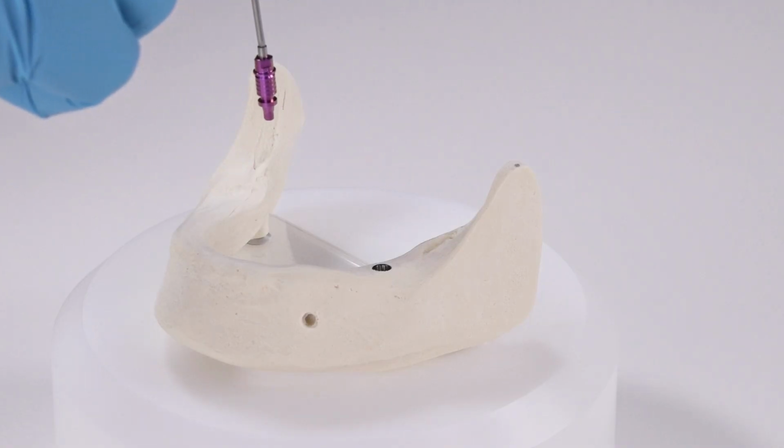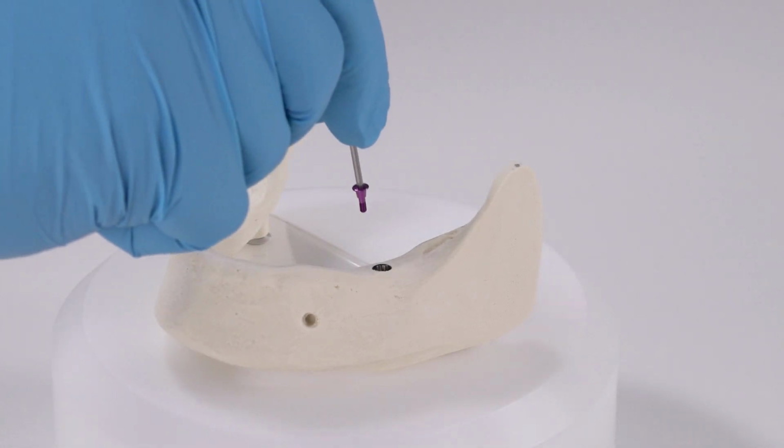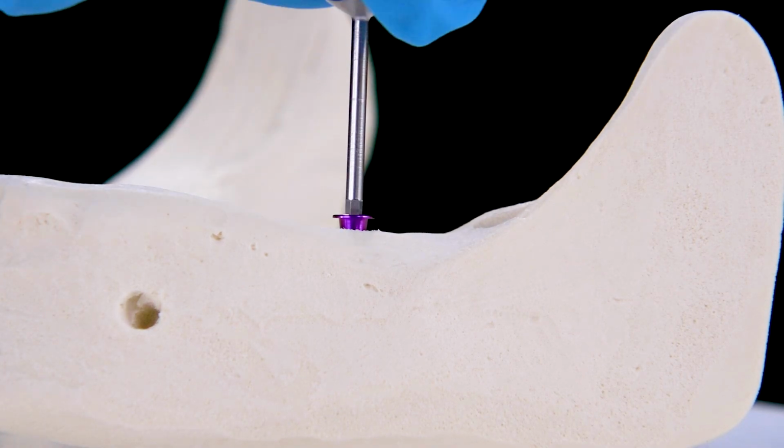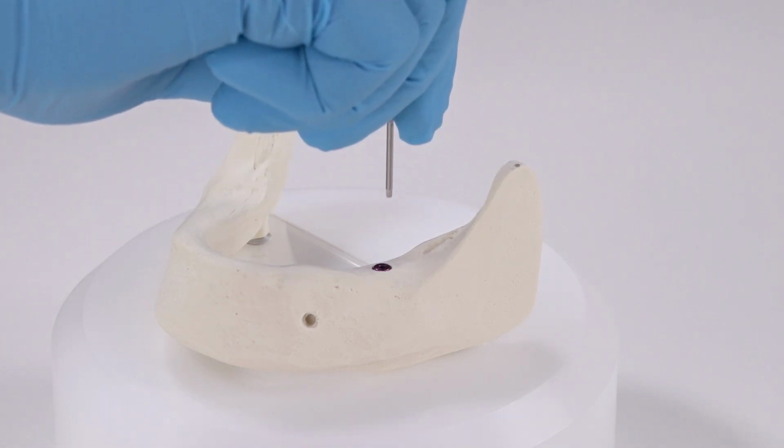Pick up the implant cover screw with a screwdriver hex and insert it into the CONELOG progressive-line implant manually controlled. The implant cover screw must only be tightened manually controlled using the hex screwdriver.